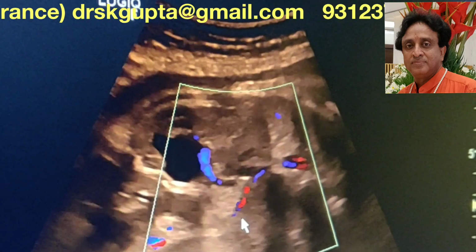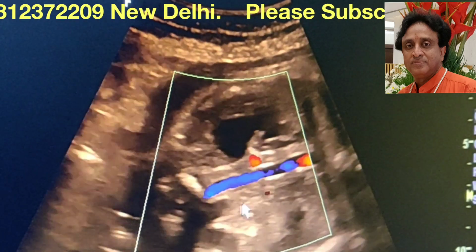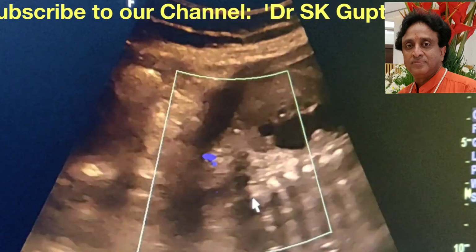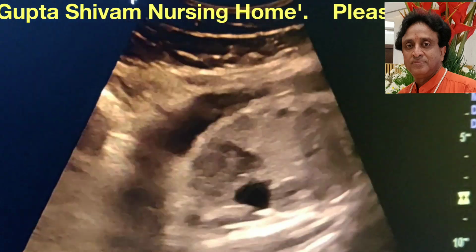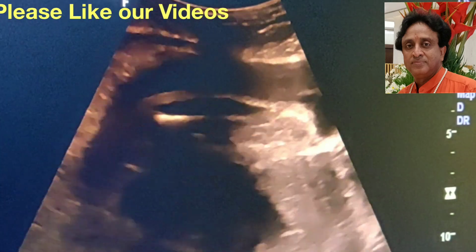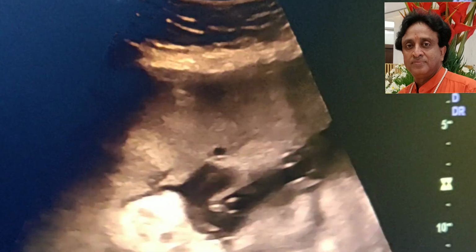And this is most probably the kidney. Now once we have seen the kidney, this is the kidney, most probably, which is slightly hyperechoic. But because the bladder is full, now I will try to show you the bladder. Because the bladder is full, it means that at least one of the kidneys is functioning well. Let me try to show you the bladder.